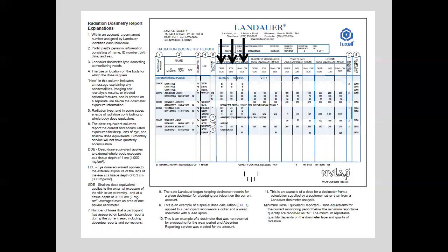We just had Balaji borrow one of our visitors' badges for 5 months and run around, and he actually got a pretty good amount of radiation. He got a little more than I was hoping he would. So, yeah, I was a little surprised by that. He had it for 5 months, and he got some radiation. I've monitored fellows before with the visitors' badges, and this was the highest I've seen in 4 or 5 months, which kind of worries me, you know, especially if you just had a kid. Just kidding.